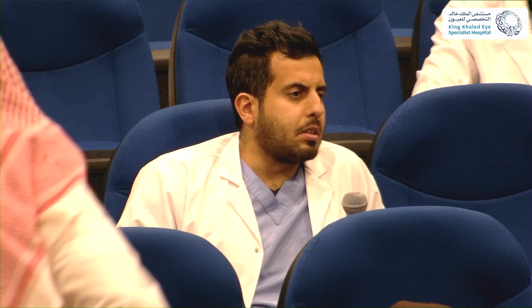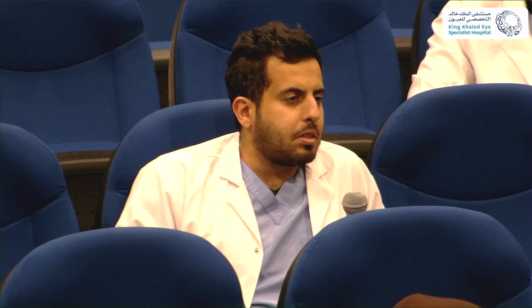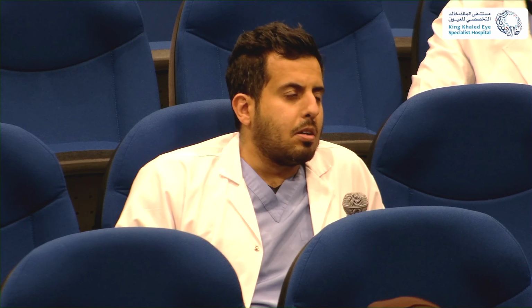The idea is, actually, thank you, Dr. Ramzi, for the topic. It opens a very good discussion. There is a lot of room for improvement in retinal detachment repair surgery in general, and this is one of the techniques that were thought of. There is another by Rajiv Moni, where they described minimal gas vitrectomy in order to achieve retinal reattachment with a small gas bubble and not cause retinal displacement.